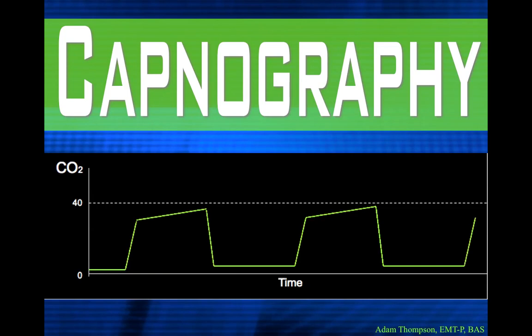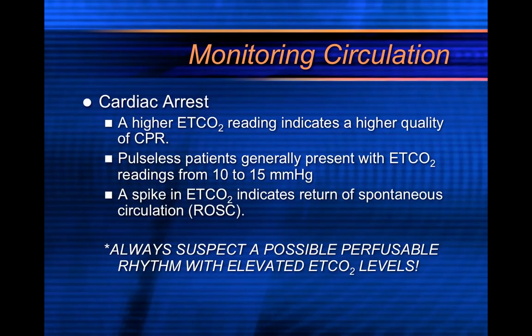This is part 5. In part 4, we talked about how you can use capnography to monitor ventilation. I think most everybody grasps that concept. It's not too difficult to understand. Now we're going to talk about how you can use capnography to monitor circulation.